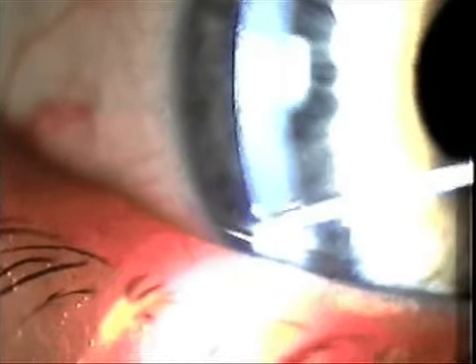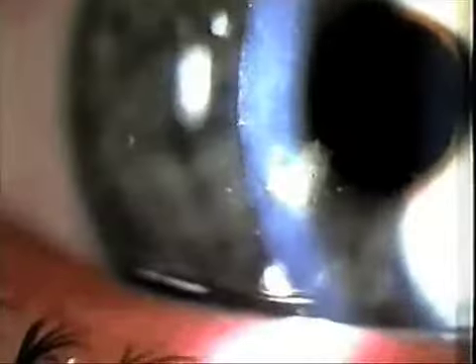We use this special hook. What this does is it cleaves the epithelium evenly. We identify it at the slit lamp, again trying to minimize the epithelial disruption with an enhancement, much like you see in a primary case. So under direct observation, we then can make an indentation that's straight up and down in the area of the flap.